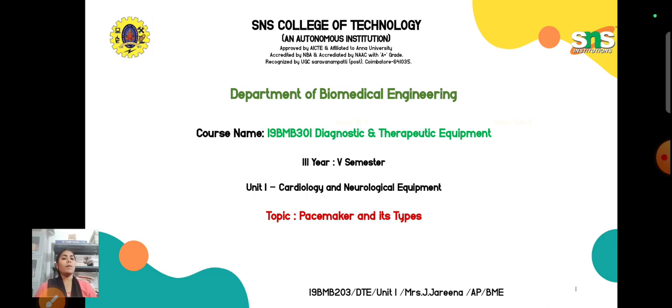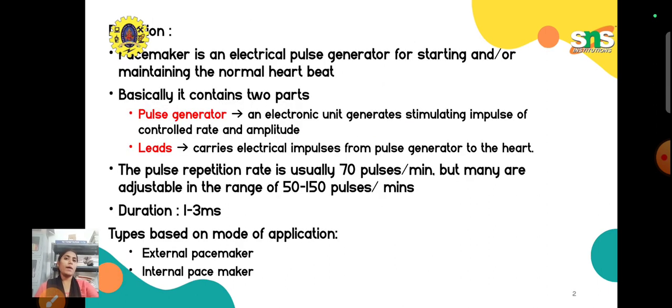This pacemaker is going to replace that problematic area which is not properly generating action potential. That place will be replaced by this medical device. This medical device now generates the electrical pulse to maintain the normal heartbeat. So this is the need for which we have to go for a pacemaker.